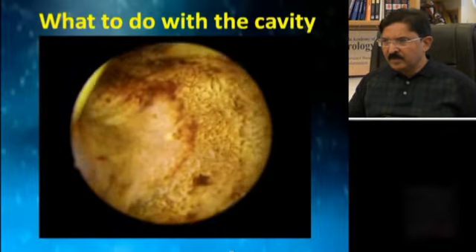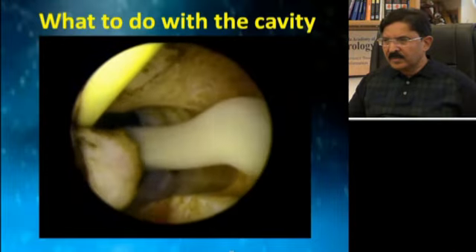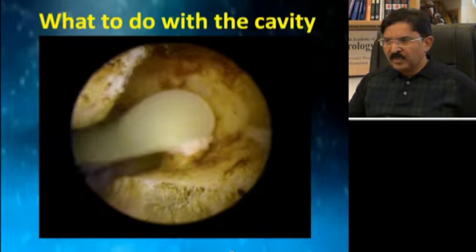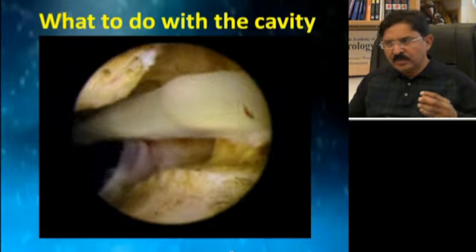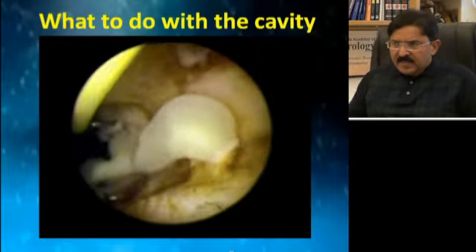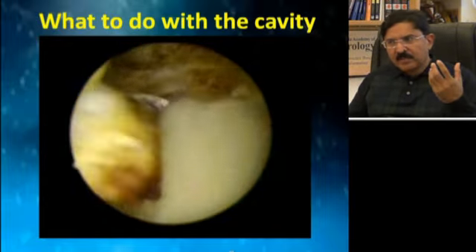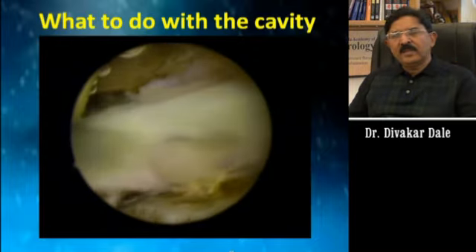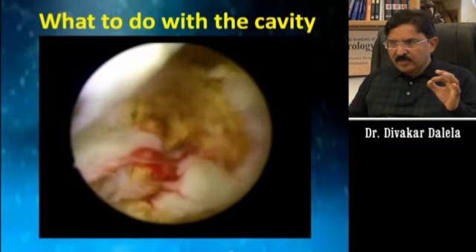So as you cut one loop and you cut the second loop, the abscess starts welling out. And you just made a small hole in the abscess cavity. By the very speed of the flow, you know that the abscess is in tension. By the way the pus is flowing out, try and gain information about viscosity. Now, if you think it is viscous, you have to make the size of the hole a little larger so that the pus flows out properly.